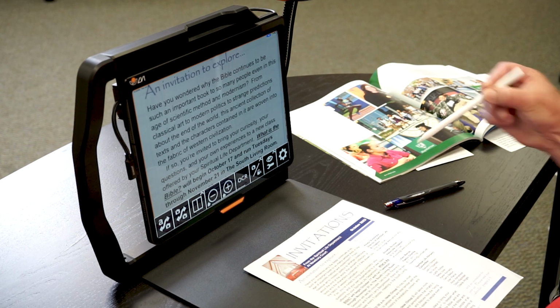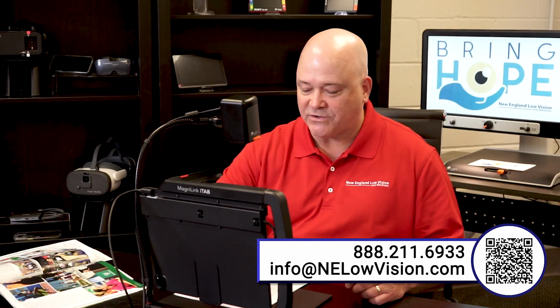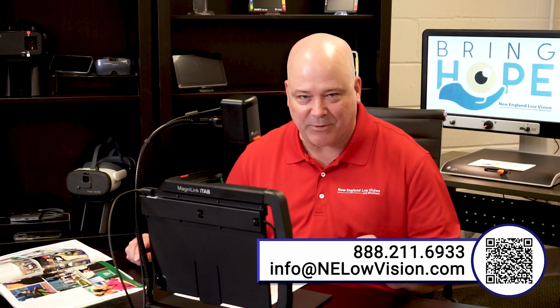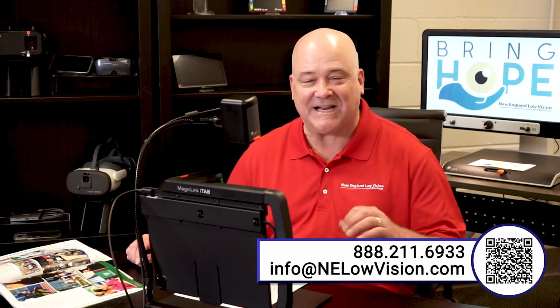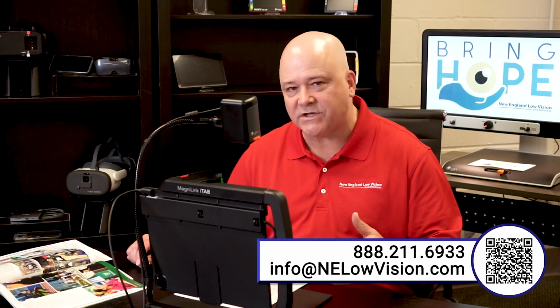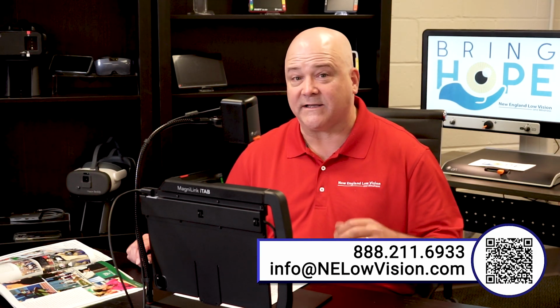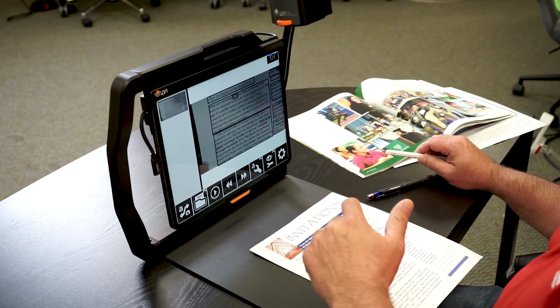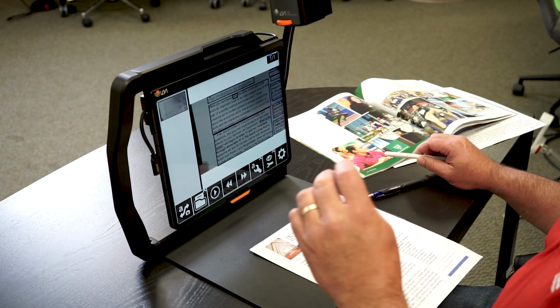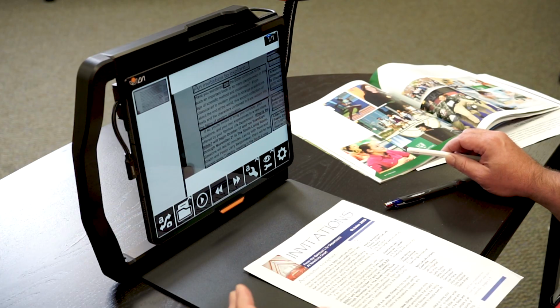So we're going to tap the button for OCR, and I don't know if you saw that, but there was no camera trickery there. It scanned and turned it into speech that fast. And that's the same way it works on the MagniLink S, and the same way it works on the MagniLink Tab as you saw it on the iTab. So it is less than a second, less than a split second to turn your information into speech.